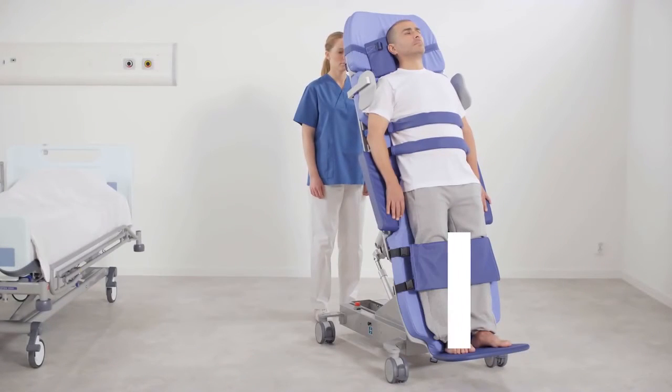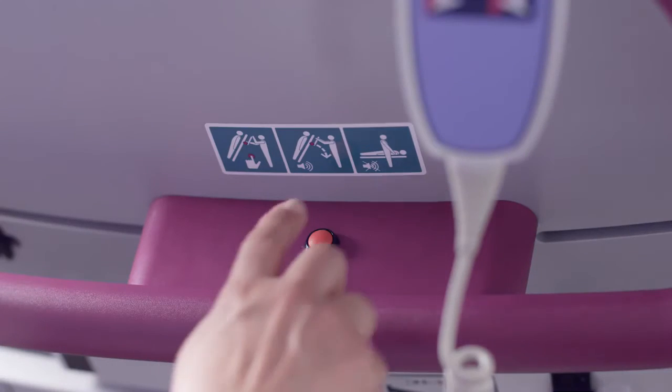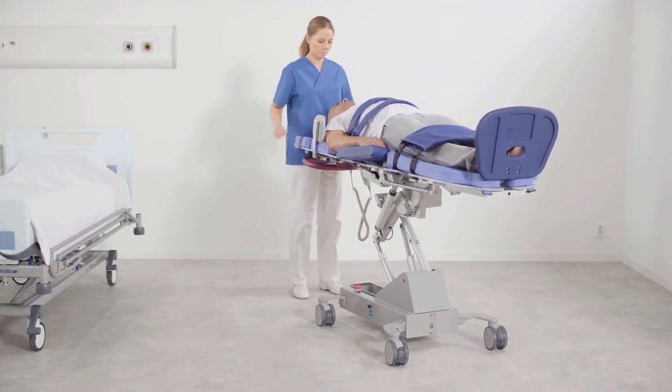It's possible to manually quickly lower a patient from a standing position to a horizontal position. First, press the tilt table release button to unlock the tilt table position. A beeping sound indicates that the Sara Combilizer is ready to be lowered manually. Depending on the original angle and the patient's weight and position, considerable effort may be needed for manual operation and can require 2 caregivers.